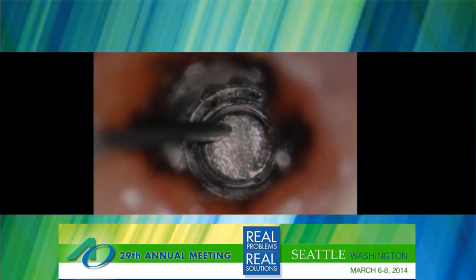But it took about 20 minutes maybe to take this screw from where it was initially at about 10 o'clock over here to 3 o'clock, and so I'm moving it up. And then you see the next image that we've taken along this extraction, and the screw is actually up out at us, and it looks like it's gone up just a little bit, but in fact I'm up 390 degrees from that last image. I've gone around once all the way up, and at this point the screw became easy to take out.